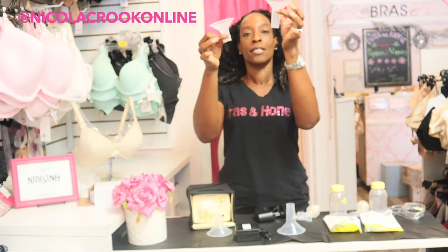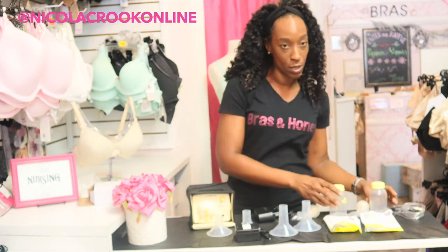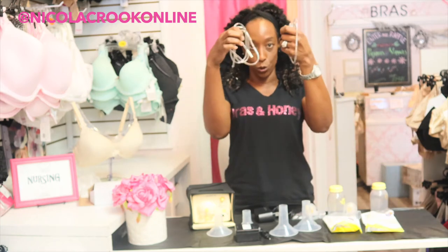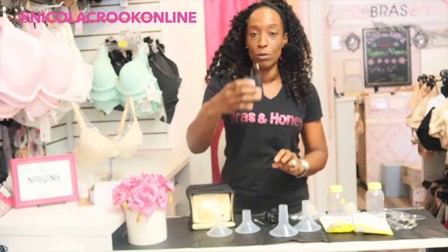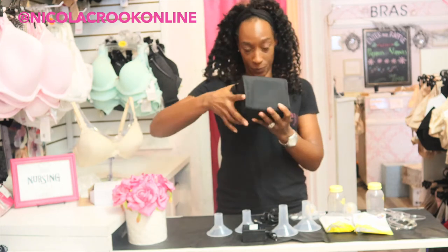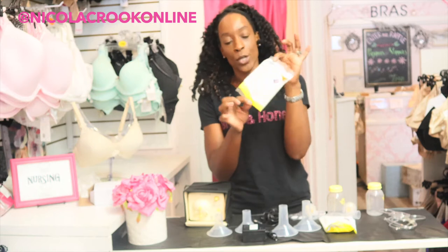You can see that this is a 27 mil and it is longer than the 24 mil, so you can decide which one's going to work best for you. You also get two bottles, two connectors, two lots of tubing, the plug socket, a battery pack, and the most important part is the actual pump itself which you get in this lovely little case.